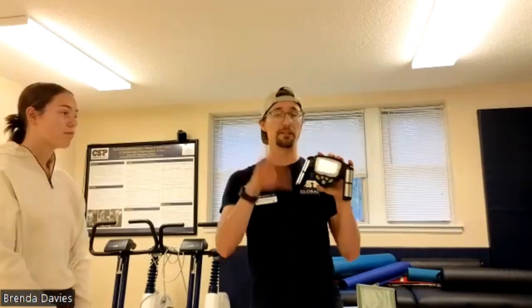So again, different numbers. BMI does not measure these percentages at all. That's kilograms over meters squared. So they're completely different. They are assessing the body, but BIA and bod pod are looking at body composition.